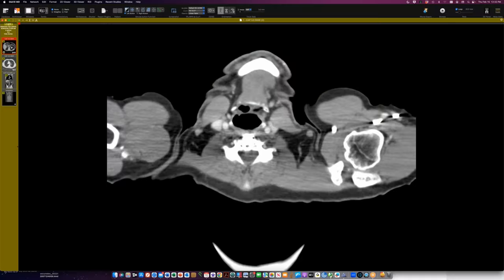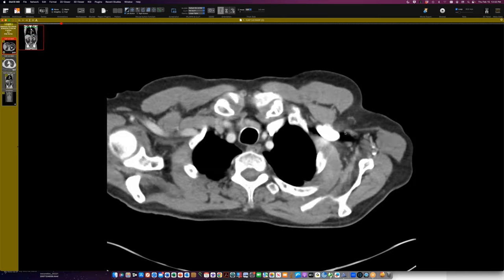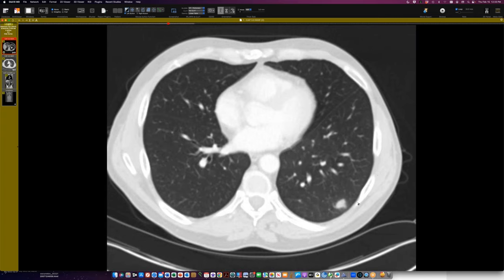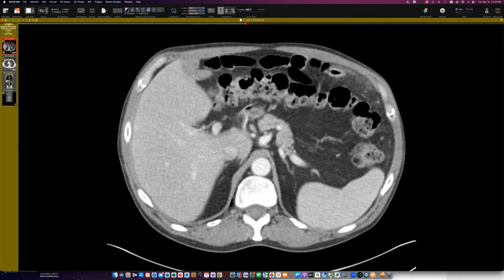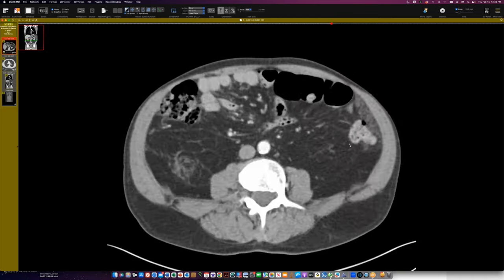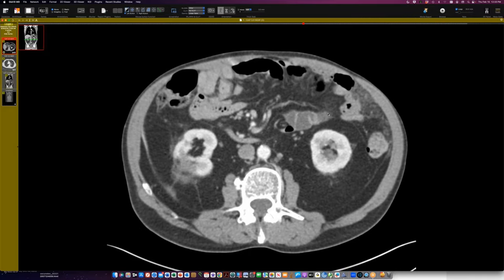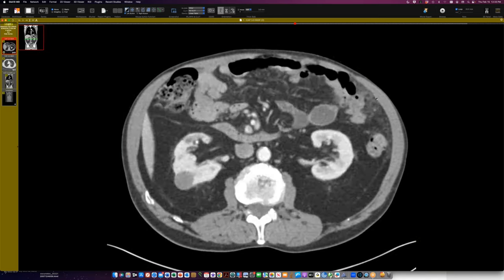This person has a lung nodule and in the upper abdomen has stranding anteriorly and in the right inguinal region an abnormality — this was biopsied and found to be mesothelioma. This is probably part of the peritoneal mesothelioma. They also have a kidney cancer here.